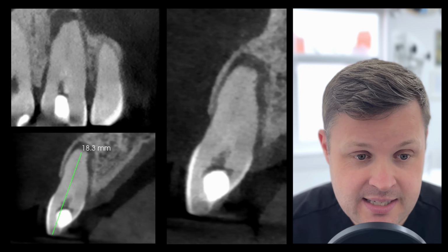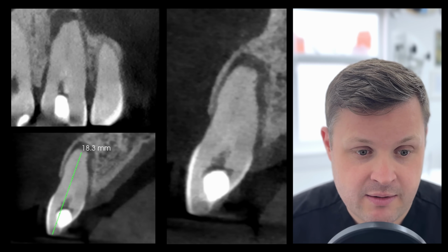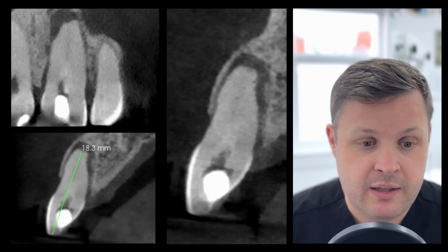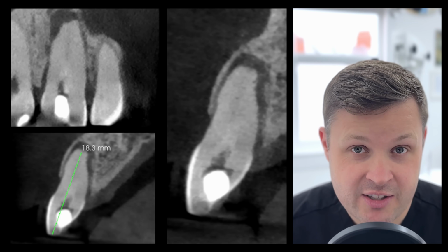Straight away with these cases, what I like to do is take a cone beam CT scan. Now, a lot of endodontists or special interest dentists would argue taking a cone beam CT scan in these cases might not be worthwhile. I can see their argument for that, but I like to see if there's any obvious canal space on the tooth. So if we move over to these cone beam CT scan slices here, we can see that there is obvious canal space here. It also gives you an idea of how deep you should be going. The measurement tools on the cone beam CT scans are pretty accurate.